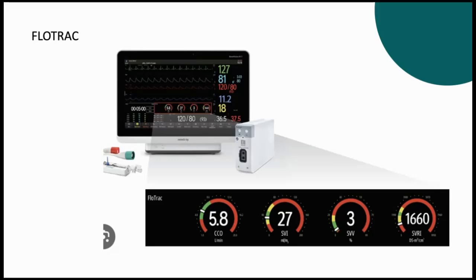Indexes are always calculated from the patient's body surface area, that is, the weight and height. So it is very specific for this particular patient. If you go with SVR, that is a generalized number, so your range is kind of narrow, usually from 1000 to 1500. If you go to SVRI, you might get a broader normal range. If you touch on this, you will see the normal ranges of that particular patient, right? So that is how it is.